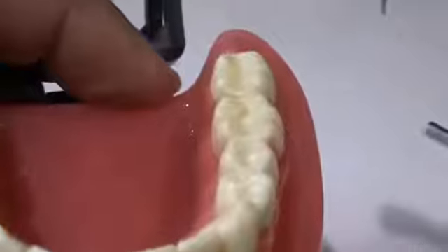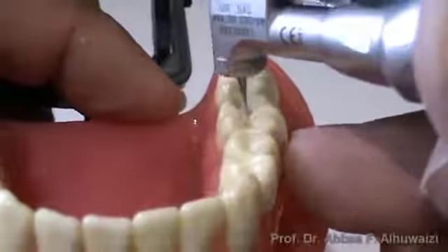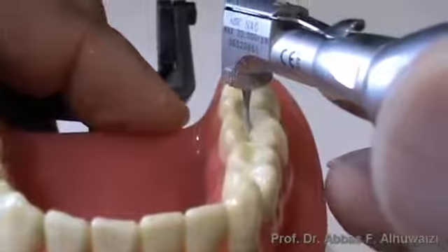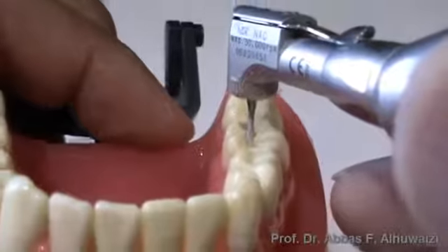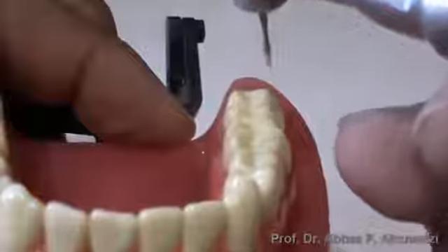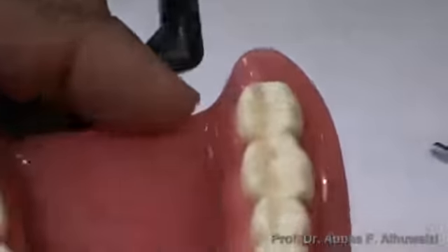Here, the burr is perpendicular. The walls, the buccal and lingual walls, are perpendicular to the occlusal plane. They should be converged occlusally about 5 degrees.